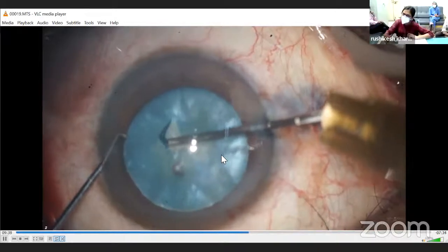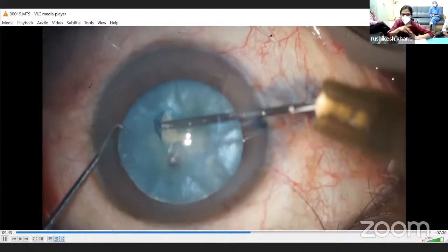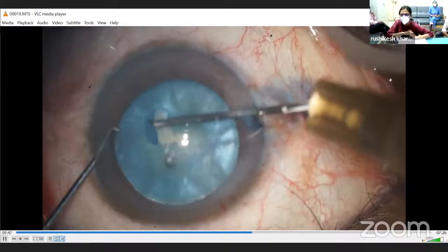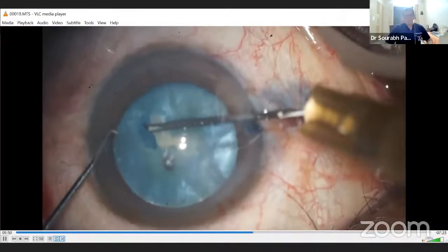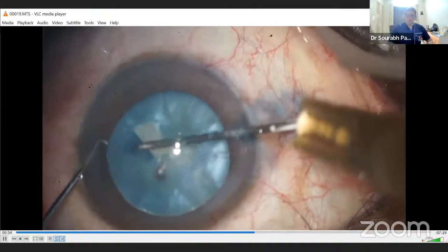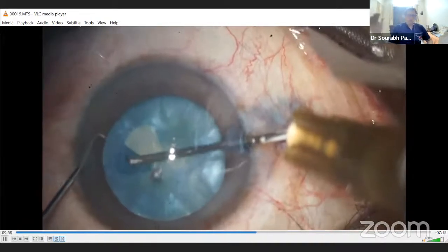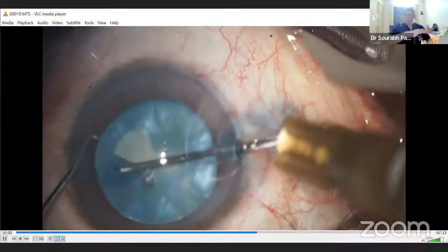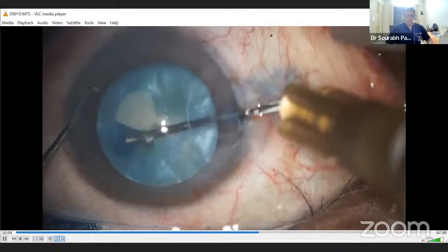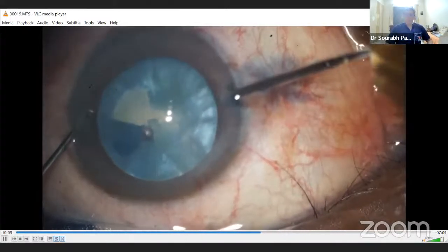We had started first, and this was my initial intumescent cataract. I was not so observant to clear all the fluid vacuoles. Yeah, so what you should have done is peripheral stroking, which we do with the visco cannula. So you milk the cortical fluid from all 360 degrees towards the center. So that flattens the anterior capsule completely. Once that is done, it's like a routine lens.